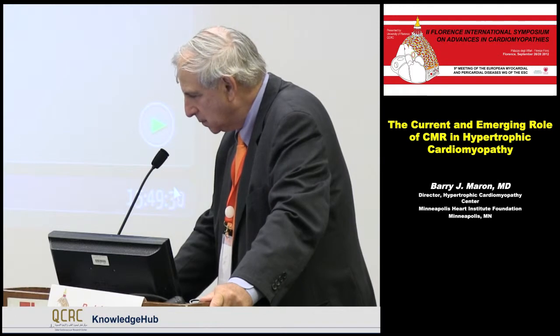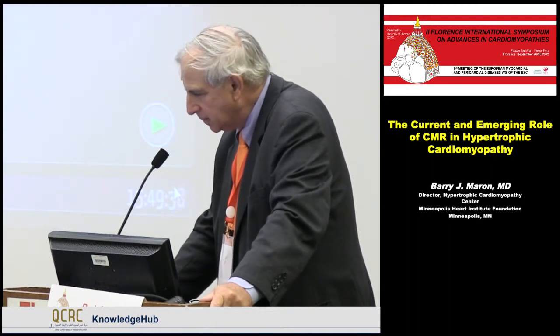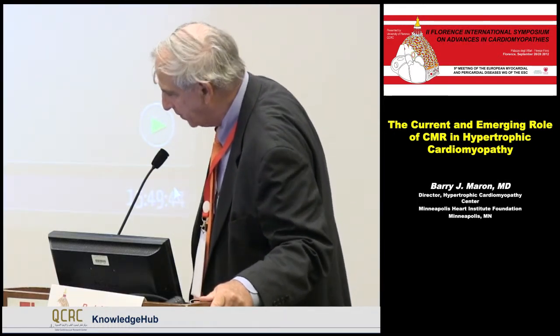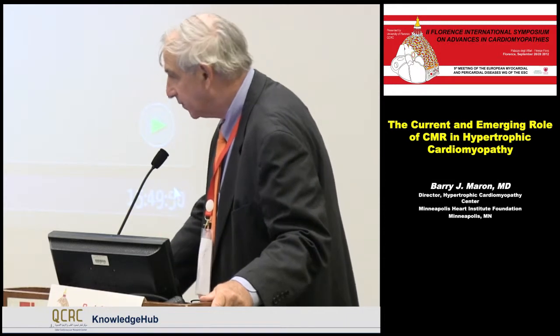We have to repeat magnetic resonance in patients with no existing criteria, risk factors, and without indication for ICD. Right, we do that. Every visit, which is usually on an annual basis, includes MRI. So I agree with you. What you're saying supports what I'm saying, right?